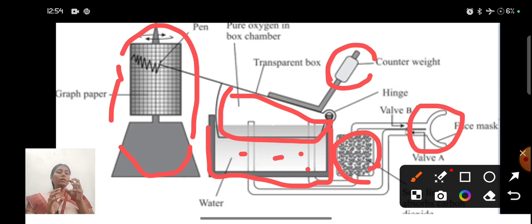The reason for having this canister in the setup is that in some cases we have to do a multiple breath test, or in some cases they can go with a single breath test. When they are doing so many expirations and inhalations, there are more chances for CO2 to accumulate. There is reason to have a 5 or 6 breath test, or even more. Since everything is a closed setup, there is no gap or space for the CO2 or other gas to leak. Everything should be sealed in one closed system, so that we can easily calculate the volume of the lungs and so on.